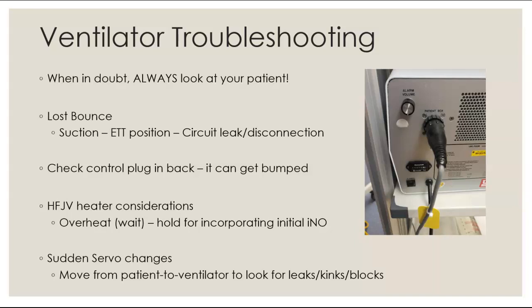One thing that is honestly the most annoying troubleshooting, but it is what it is: the cassette will overheat on the jet sometimes, especially if it's for a baby that's on the jet for a while. So that wait button, I'll just let it cool down for a little bit. Sometimes that's all it needs. And then you can just start it back up. If that doesn't work, just replace that cassette and that whole circuit. That whole circuit is all in one. You just have a friend bag for you while you replace the jet circuit, and that should fix the problem.